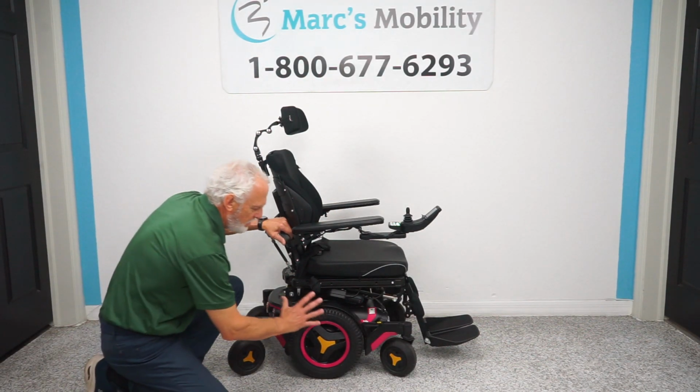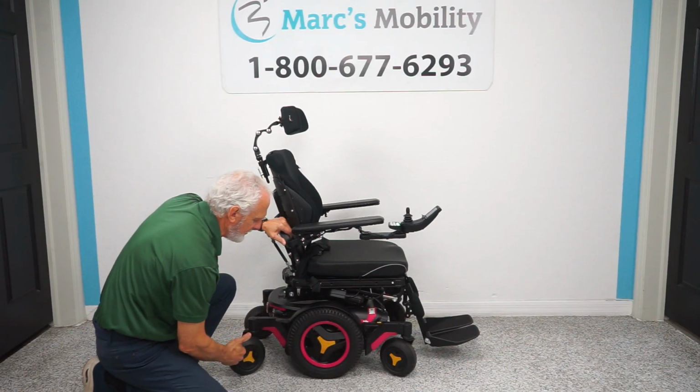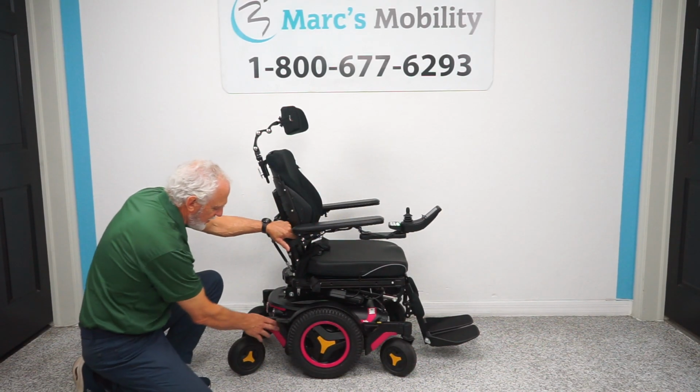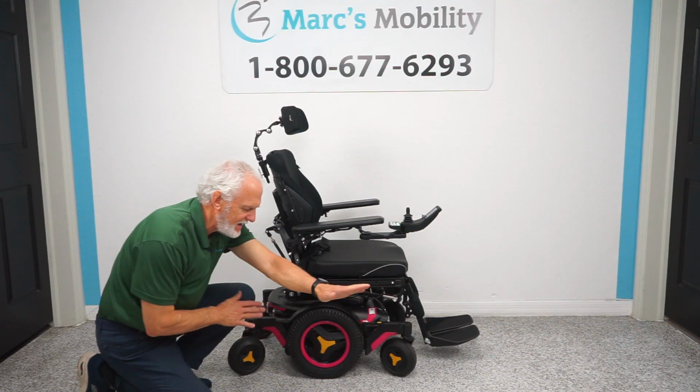Okay. So this is a mid wheel. Mid wheel means your drive wheels, your big wheel, is going to be in the middle of the front and back wheel. Okay. When you have a mid-wheel drive, you always have a fork and a wheel on the ground in the front and a fork and a wheel on the ground in the back. They're always there to keep that suspension and give you that nice turning radius.